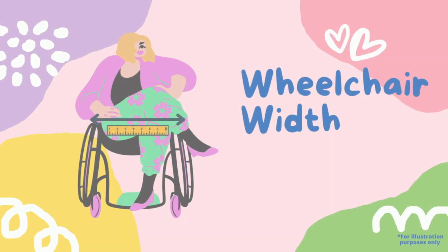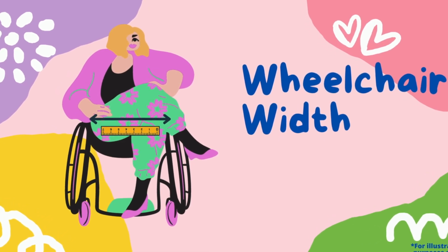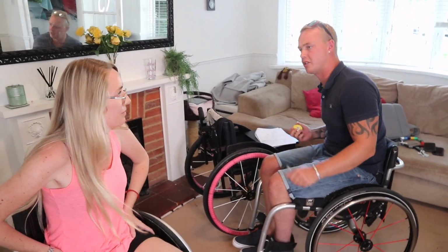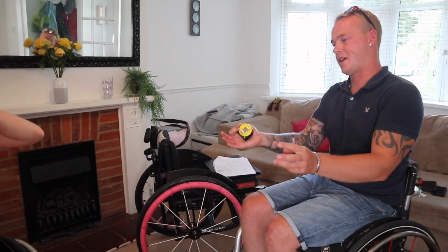I think that sounds good. Are you happy with how wide your chair is? Yes, I am. This is quite an important one. Okay. It came up quite a lot from you guys talking about width. So when people come out of hospital and they're firstly injured, I've heard that people tend to overcompensate. Yeah, absolutely, because you don't know, you could potentially gain a little bit of weight, so they always give you a bit of a bigger chair.